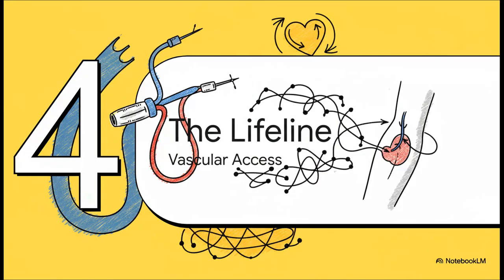Mr. Lim's urgent dialysis was done through a temporary catheter placed in a large vein. This was totally necessary for the emergency, but it brings us to what is arguably the most important long-term factor for any dialysis patient, their vascular access. It is truly their lifeline.